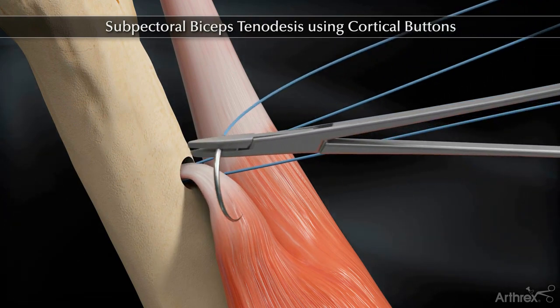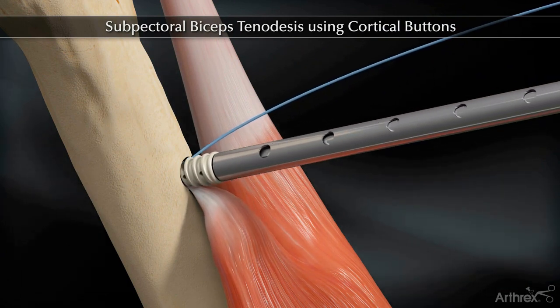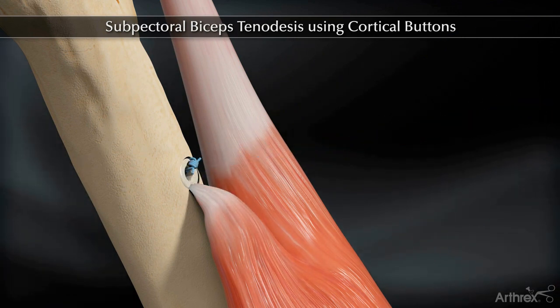Pass one suture limb through the tendon and tie a knot. Load one suture limb through the tenodesis driver and insert the screw. Tie the suture limbs over the top of the screw to complete the repair.